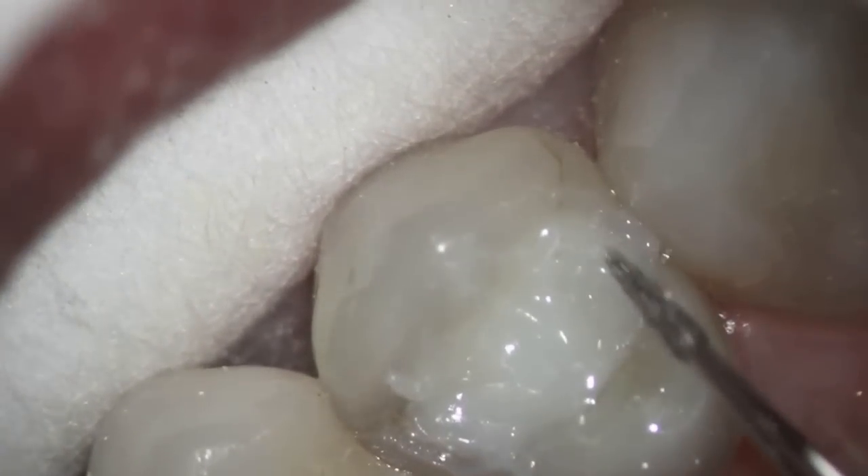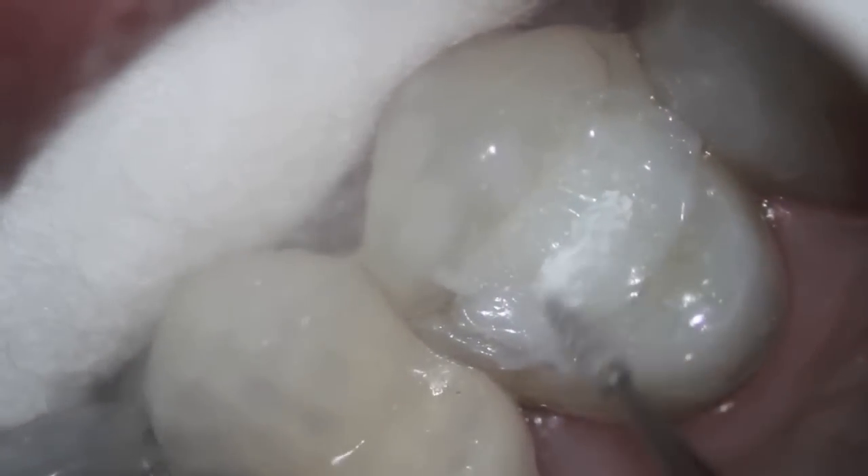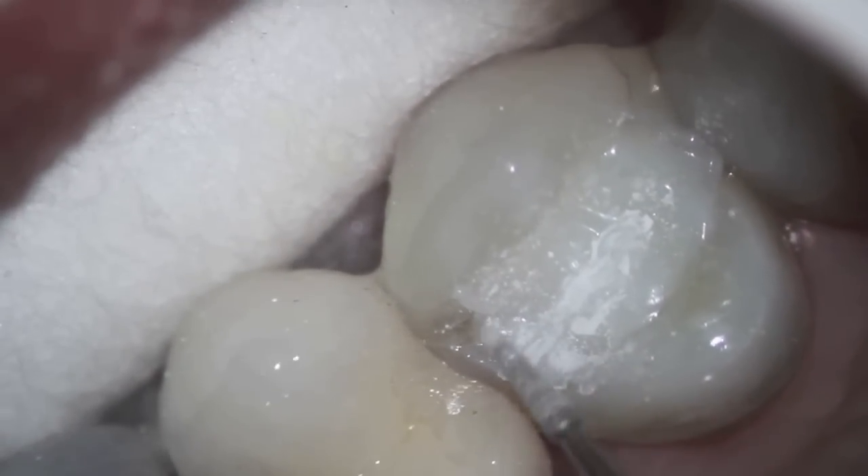The filling we're actually putting in — you can see the distal crack, which is right here. It's bonded the tooth together, but it's really not meant to last for a long period of time. If the person just leaves this, they will eventually lose the tooth, and that's clearly stated to the patient so they know it needs to be taken care of.